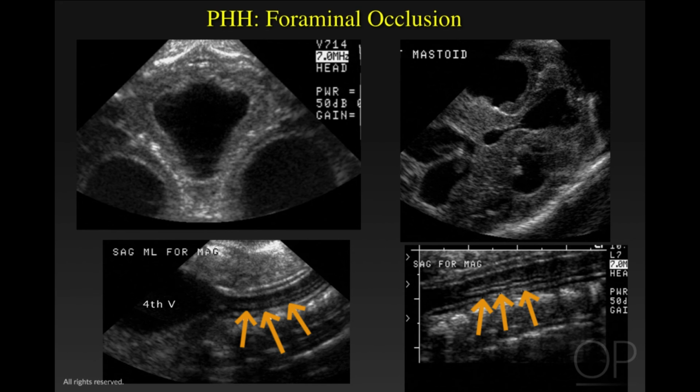This is a manifestation of the pressure that's in the ventricular system. Because the system is so obstructed, the central canal is the only way of egress for CSF. So we have outlined the entire area of obstruction and the consequence of obstruction using these four views.